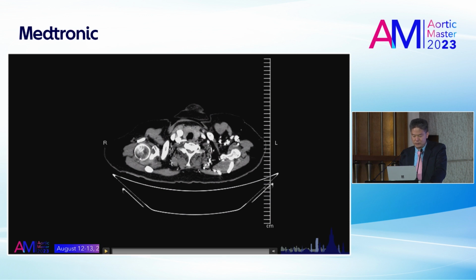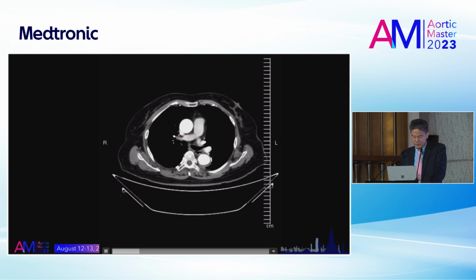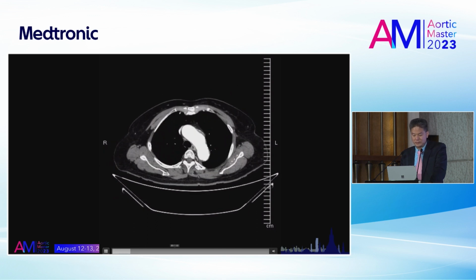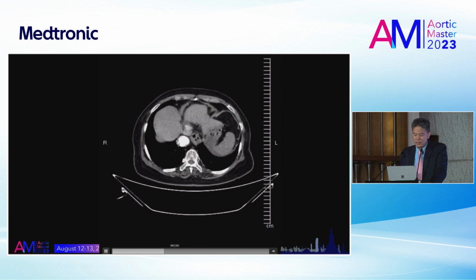Let's see if the video will play. So the patient has an occlusion of the right external iliac artery and a ruptured aneurysm.